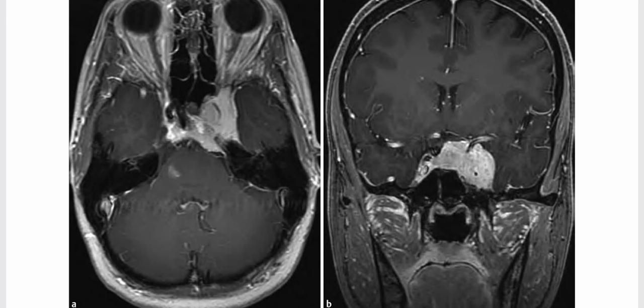This is a 31-year-old postpartum patient complaining of facial numbness. On the axial and coronal T1 and post-contrast sequences, there is an avidly enhancing left cavernous sinus mass causing encasement and marked narrowing of the cavernous segment of the left ICA.